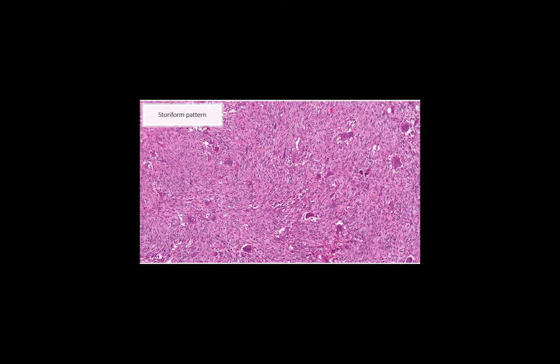And as I mentioned, this seems to be the one tumor in this differential which really has a distinct storiform pattern. So that can be a helpful feature that you're dealing with non-ossifying fibroma that would favor NOF over other things in the differential.